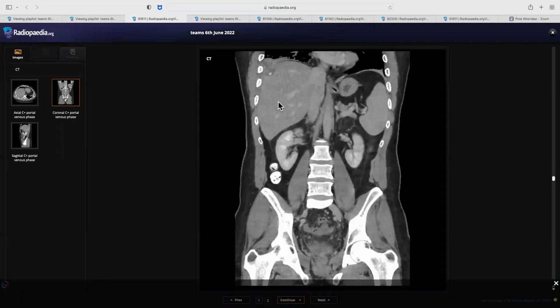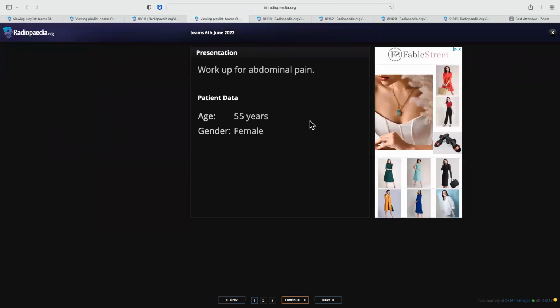So what will you do next? I will urgently inform the clinician about this, and the abscess, it's superficial. We can do ultrasound and drainage with proper antibiotic therapy, but this actually needs to be excised surgically. Okay. Can you please leave the control? So that's the next case.